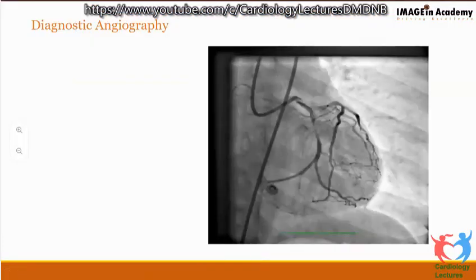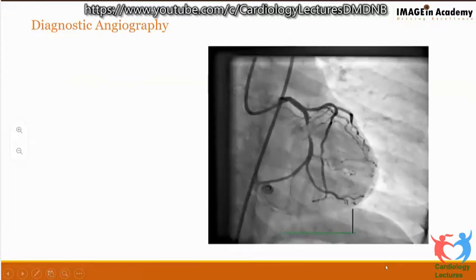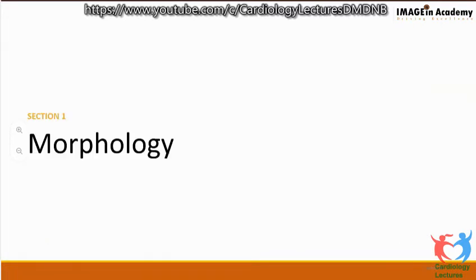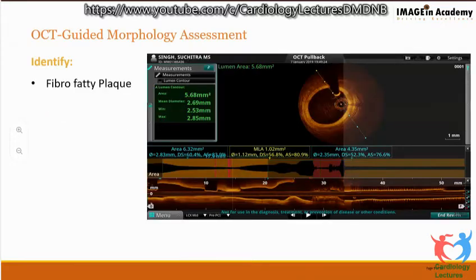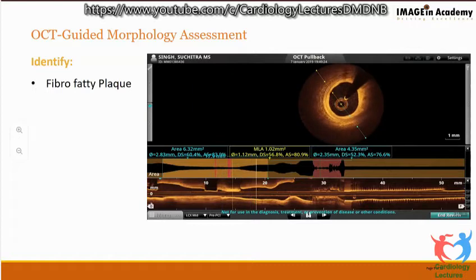This was a middle-aged male with hypertension and unstable angina, who had a non-dominant LCX and showed a discrete kind of lesion. So we used the same algorithm for the assessment of this, going by the MLD. We looked at the morphology. This is the run that was taken. We are coming from distal to proximal. We've entered the plaque segment, and you can see there is a buildup of fatty plaque, and a little intimal dissection which just went by. It is part of the lesion which we just crossed, and now we are approaching the proximal part of the lesion, which appears to be healthy.